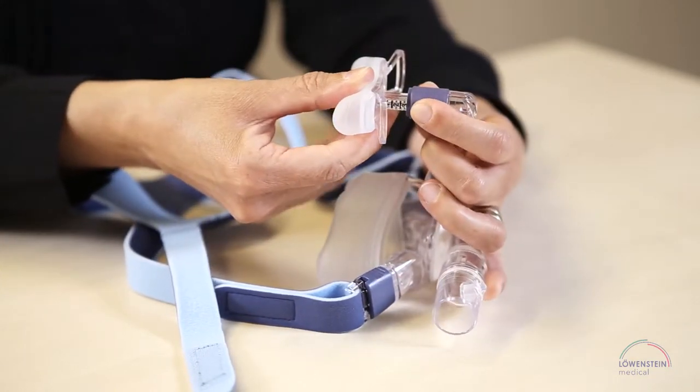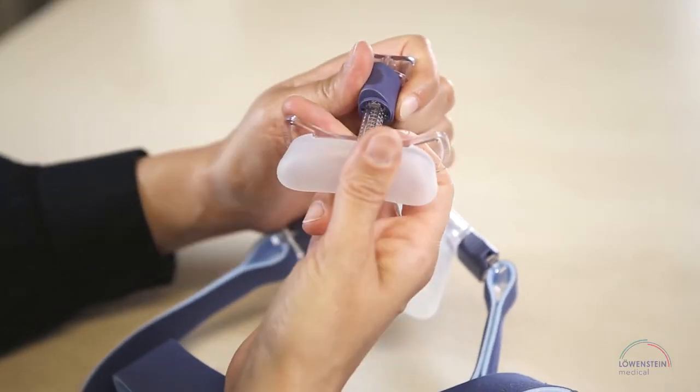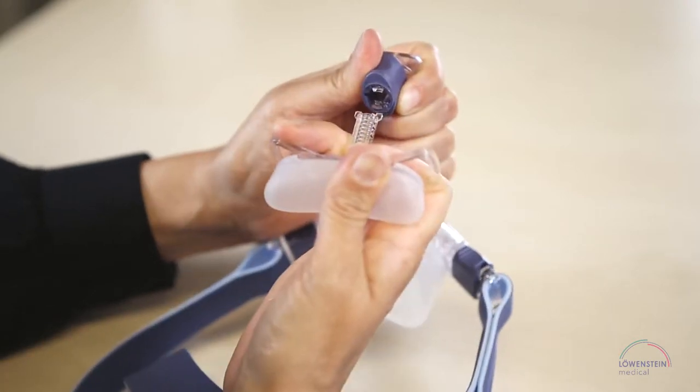Turn the blue element 90 degrees clockwise, slide the forehead support to the stop, and then pull with a little more force to remove it completely.